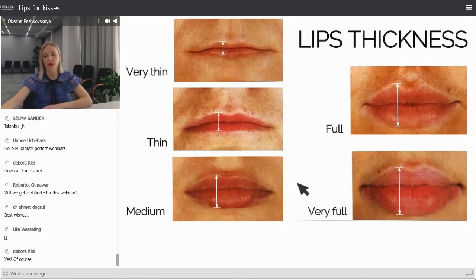It could be great, and we will also reach the correct form of the lip, because you see that to put additional volume is not a problem, but to achieve a natural, really excellent result, making a good form of lips, is not so easy. It's not impossible making really full lips from thin lips. We could, but in a few steps.